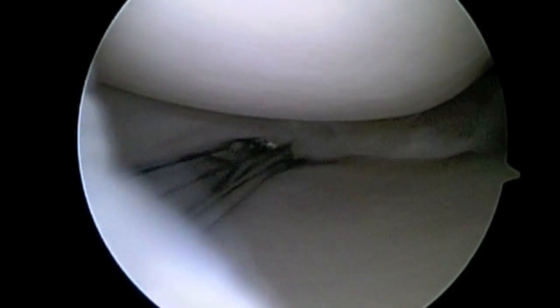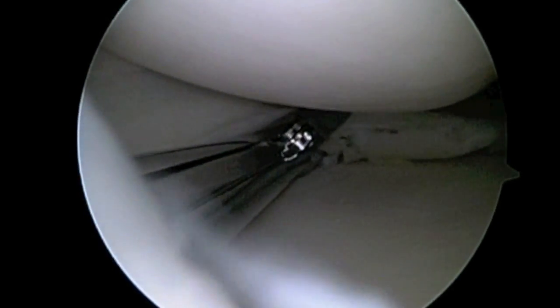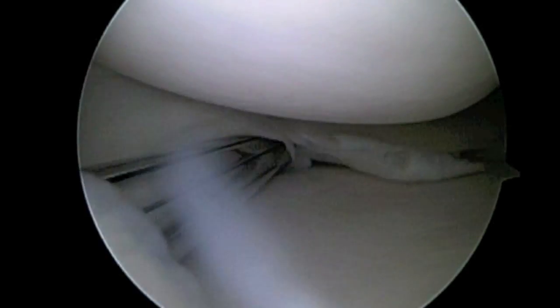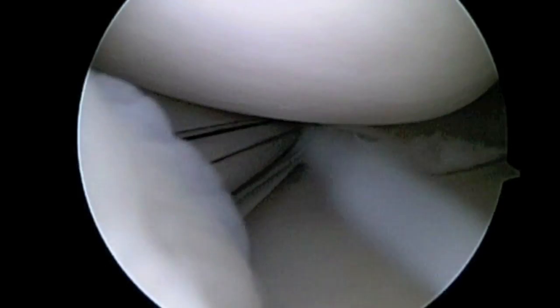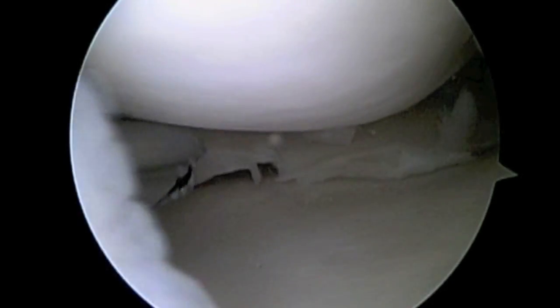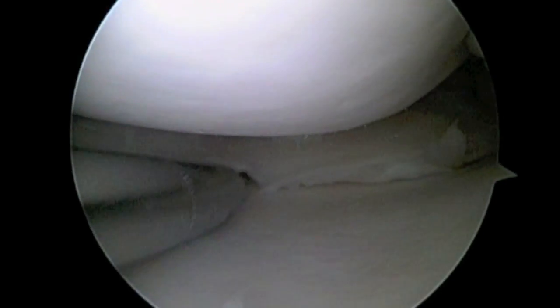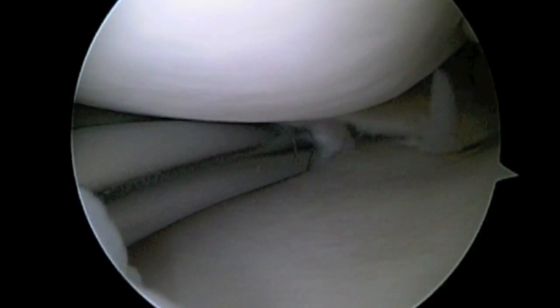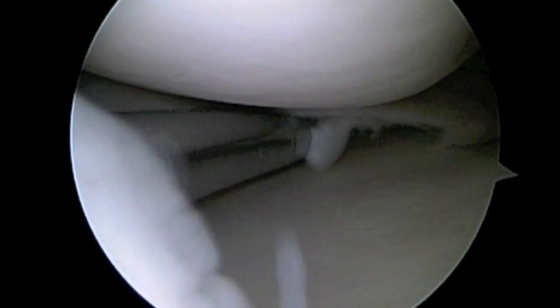We remove the tear using a combination of biting instruments such as this to remove the larger fragments of the meniscus. We also use shavers. These shave up the torn fragments of the meniscus, and it's attached to a suction, so these fragments are removed from the knee.